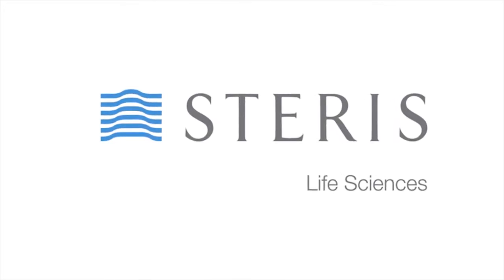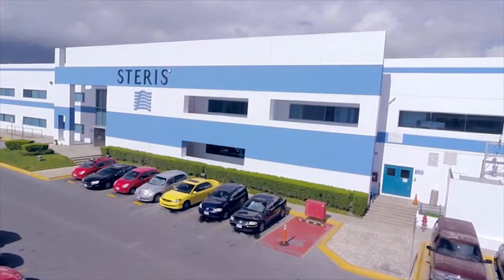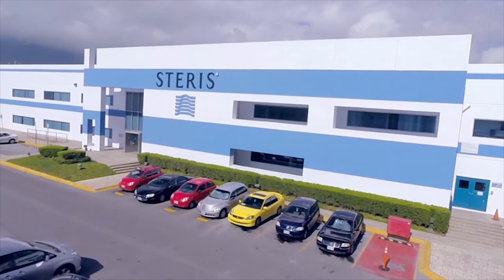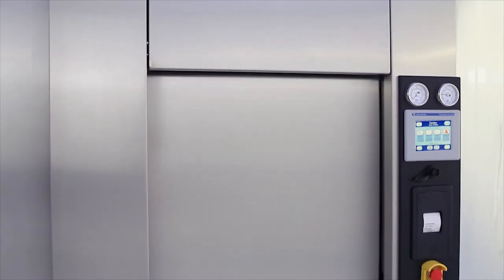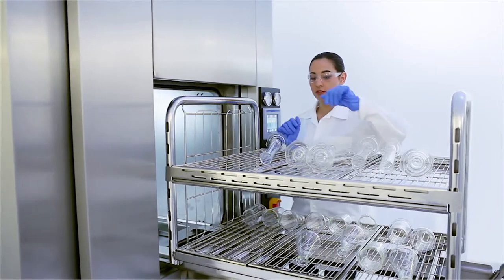For over 100 years, Steris has been a global leader, trusted partner and solutions provider in the field of sterilization and contamination control. The AMSCO 430LS and 630LS are the next generation of medium-sized laboratory steam sterilizers from Steris Corporation.